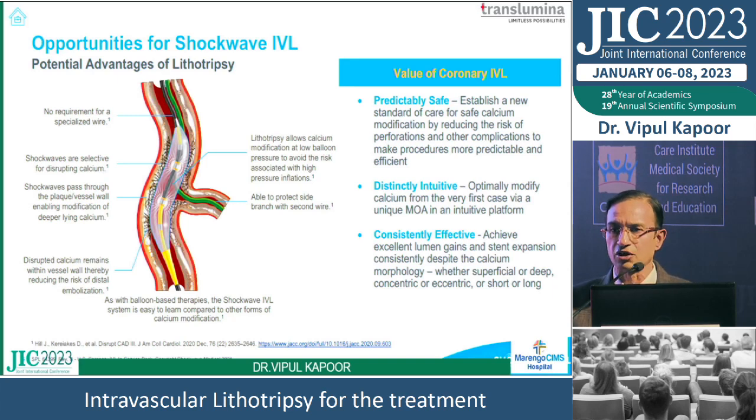Unlike your rotablation and all, you are not pulverizing, so there is no calcium which is going into the bloodstream. So there is no slow flow and other complications which commonly happen with rotablation, but here unlike that, you are just cracking it, and with that you can expand, and ultimately you can have a very good result.